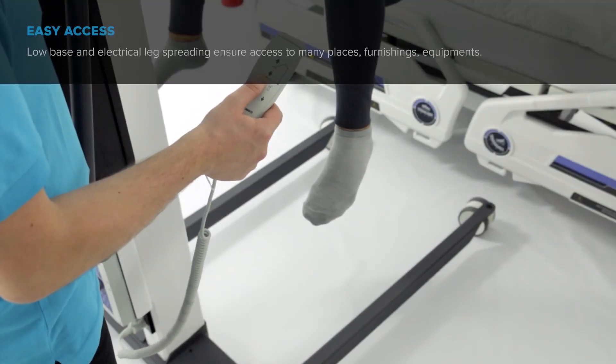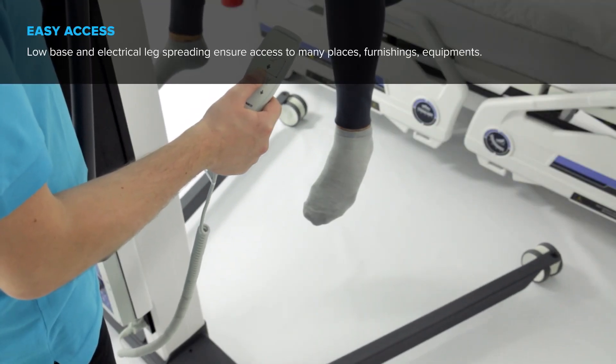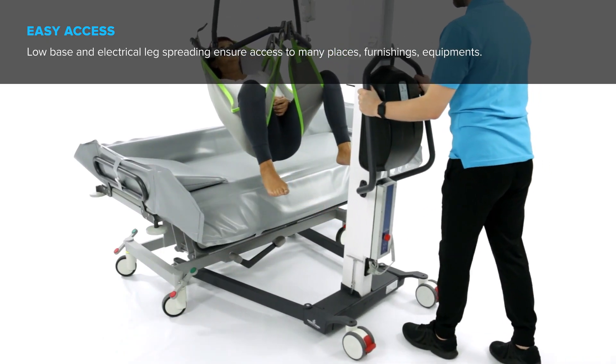Low base and electrical leg spreading ensure access to many places, furnishings, and equipment.